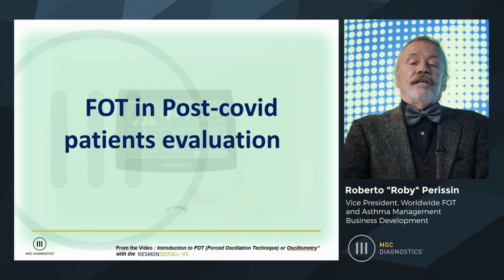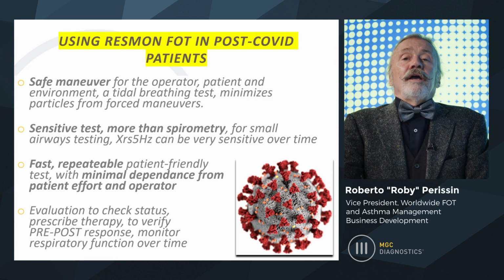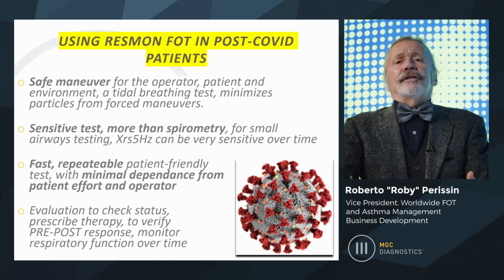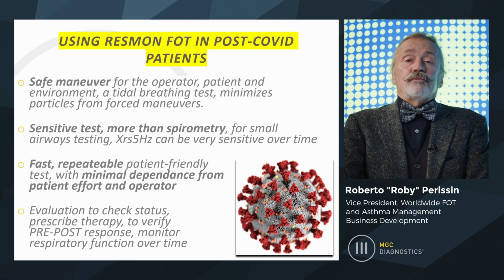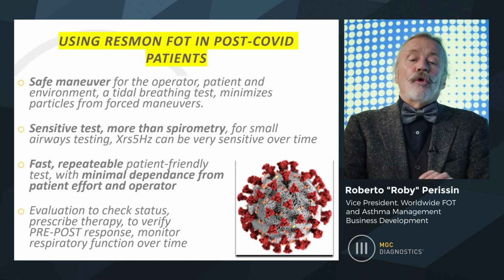Let's look now at the post-COVID patient evaluation. Well, post-COVID, it's definitely safer with oscillometry. There are fewer particles being dispersed in the room with the tidal breathing maneuver. But now that COVID is at least somewhat behind us, not completely. What's more important is that FOT is sensitive, more sensitive than spirometry, especially for small airways testing.